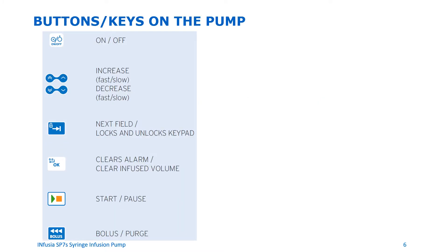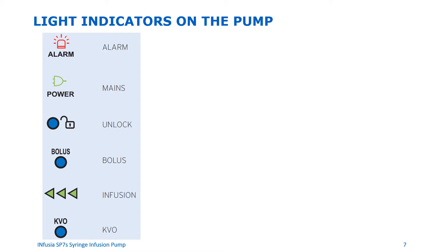Here are the buttons or keys on the pump: on-off; increase and decrease; switch button to change the infusion mode or silence the alarm; OK button to accept the setting, go to the next field, clear the alarm, or lock and unlock the device; start and pause the device; and the bolus and purge button. Here are the light indicators on the pump: the alarm indicator, main power, unlock indicator, bolus indicator, infusion indicator, and KVO indicator.